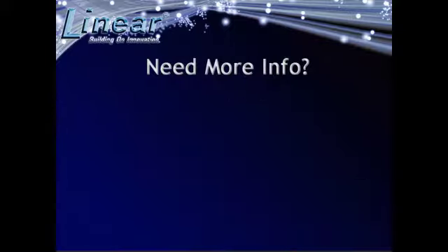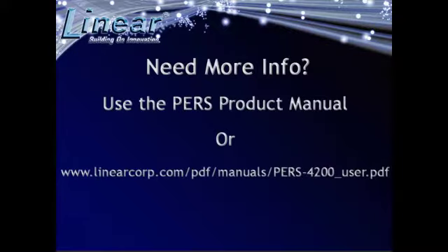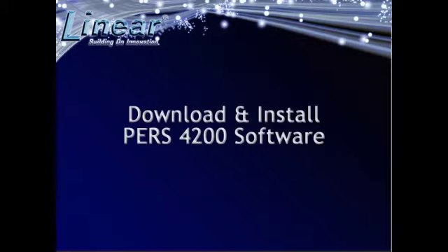For more information on the basic features and operations of the PERS-4200, please refer to the product manual. A printed copy is provided with each unit, and an online version is available at www.linearcorp.com.